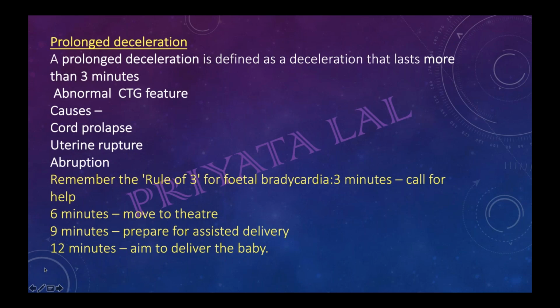Yes, ma'am. Clear. Thank you. And there is one more thing to remember that they have added in the guideline: if at 9 minutes the CTG is normalized, that is also one question that was there. If you are following this protocol, the rule of 3, and at 9 minutes the CTG was normal, then you have to reassess.